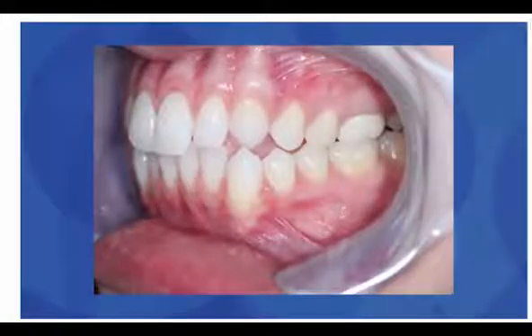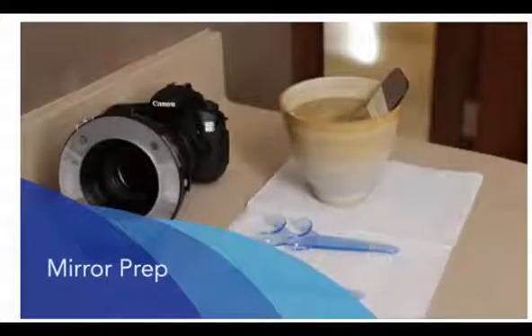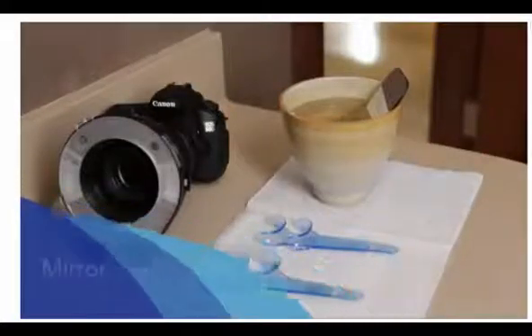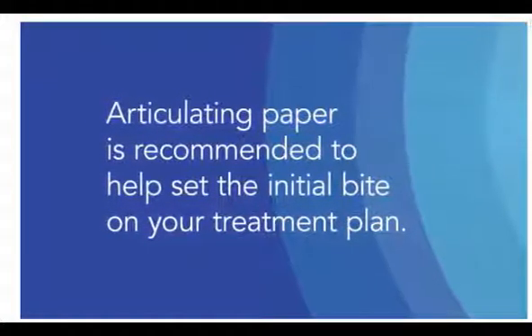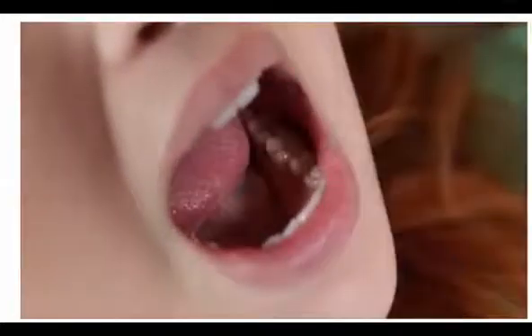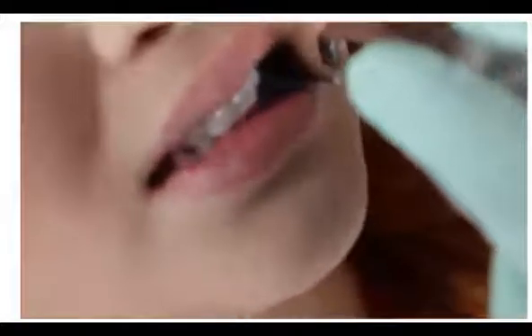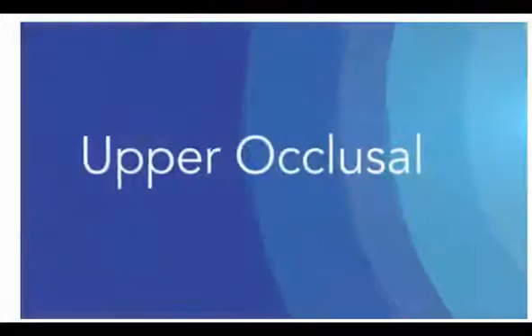Repeat the same process for the left buccal photo. In preparation for the occlusal photos, submerge the occlusal mirror in warm water to help prevent fogging. Before taking the occlusal photos, marking the occlusal with articulating paper is recommended. The visible contact points from the articulating paper will help your technician accurately set the initial bite on your treatment plan. Begin by drying the teeth thoroughly, then have the patient bite down on the articulating paper, making sure the paper is far enough back to mark the contact points on the molars. Repeat on the opposite side of the mouth. Inspect the occlusal surfaces to ensure that the marks are clearly visible before moving on.